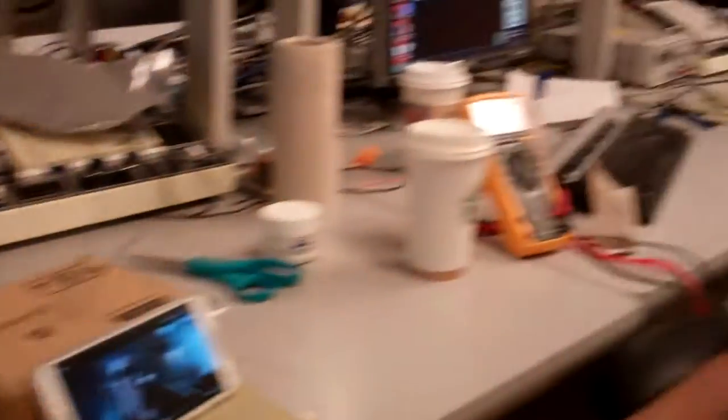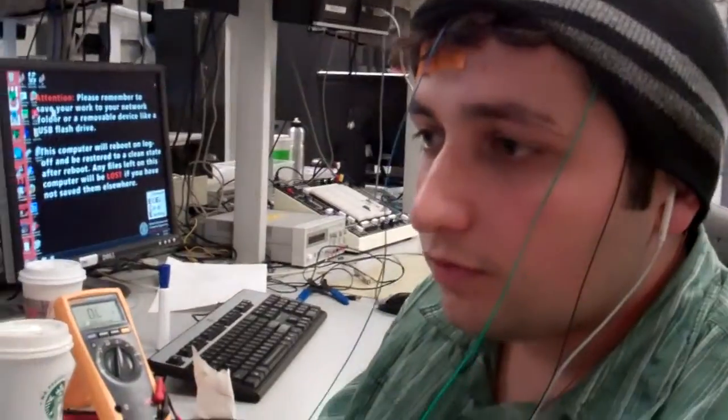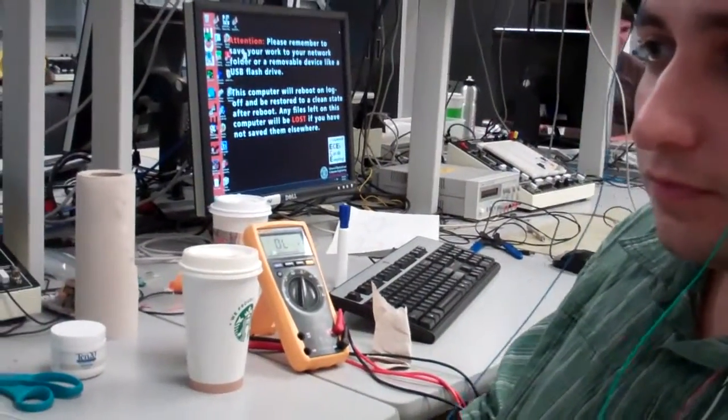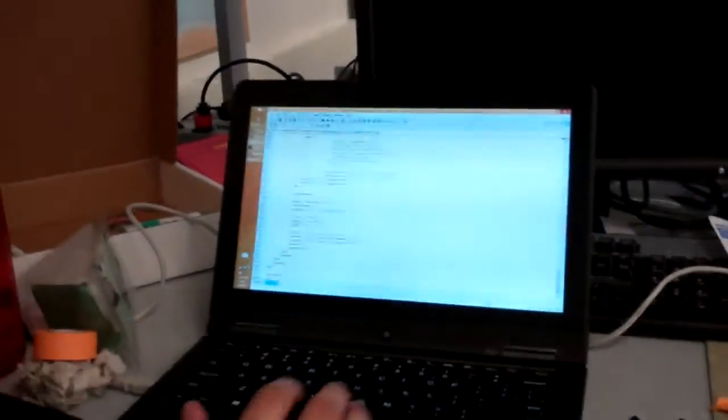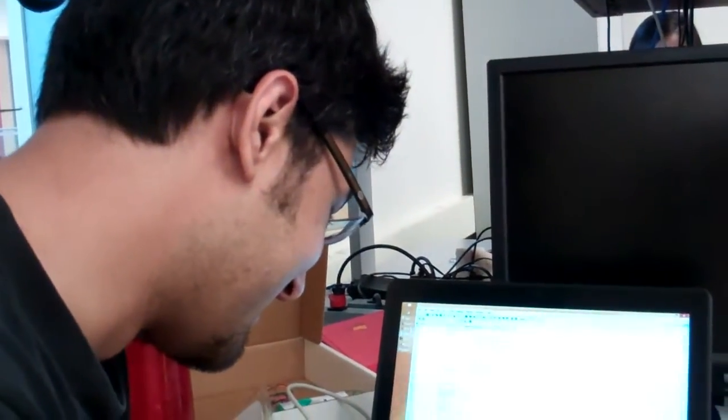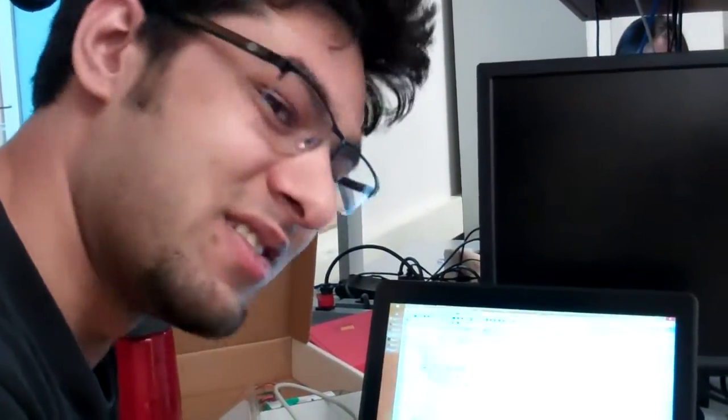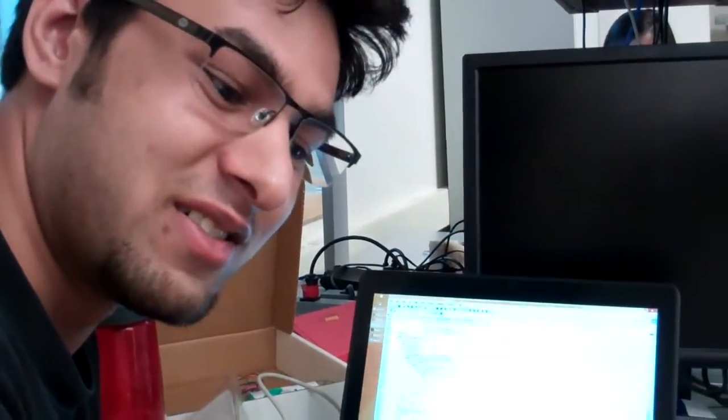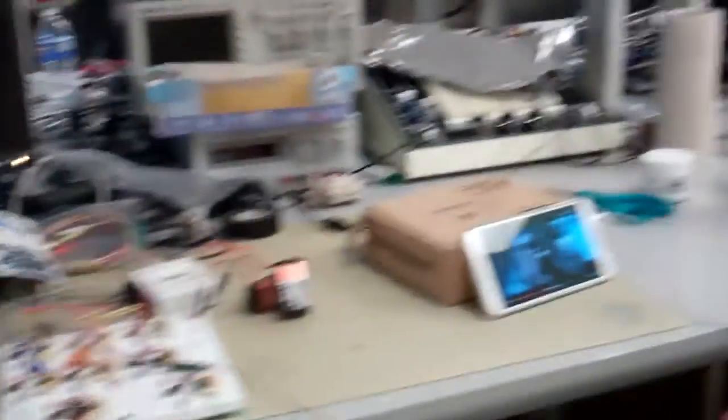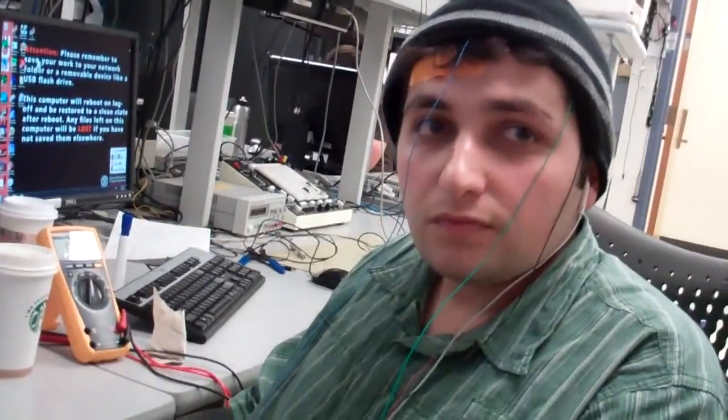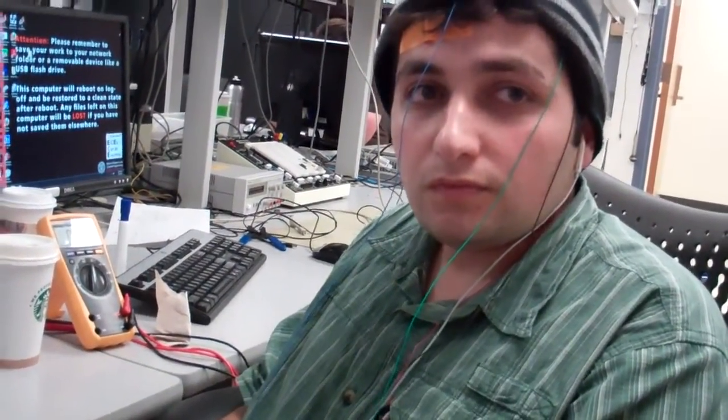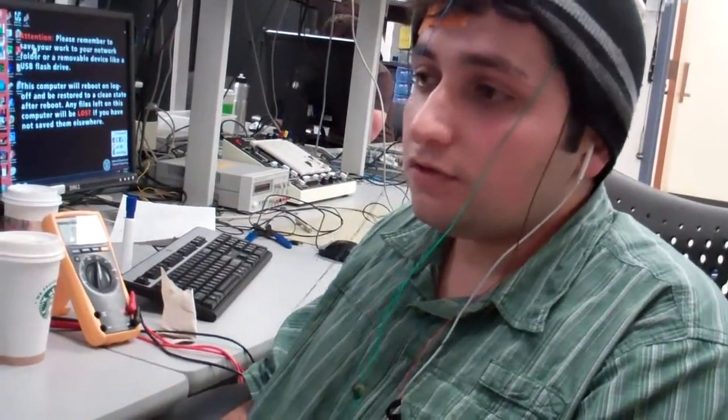And also for eye blinking, you can show that. Oh yeah, let's see the eye blinking. The eye blinking is a big signal. Yeah, it is. And it's big. It's huge. Actually, one really interesting thing is that we also get a lot of artifacts if he's just sitting down and moving his feet on the electrode that's placed here. It's just pretty interesting. We need to try to look into that. You know, that could be static, too. That could be that your foot is acting as a static electricity generator against the floor. So it may be that it's an electrical artifact as opposed to even a motion artifact. I'm not sure.